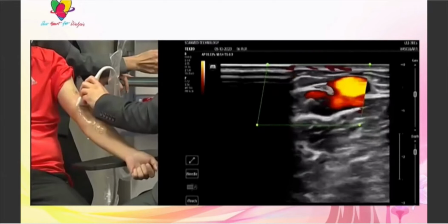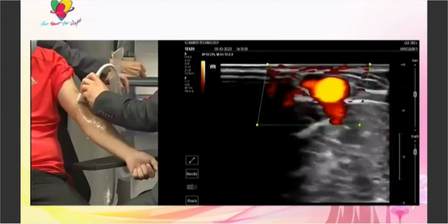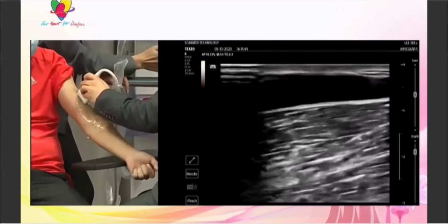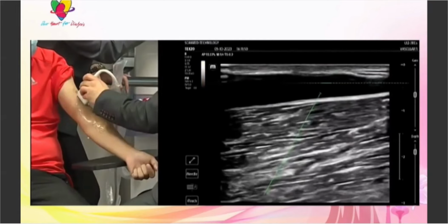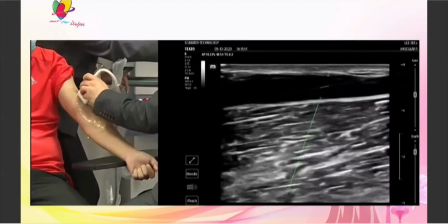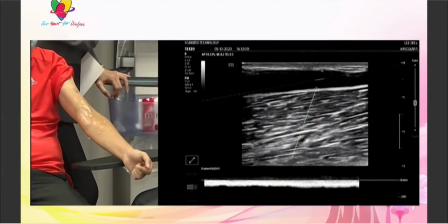Okay. So the B-flow is kind of like an angiogram using color in an ultrasound. It really shows the strength of the flow. So we would measure the diameter, which is really good, and the flow in the cephalic in one image. So can you put a PW on it, Jackie? Sorry, German accent. And again, the vein is approximate. You would compress the vein, so we usually don't measure the flow in the vein. It's just to see how the distribution is.